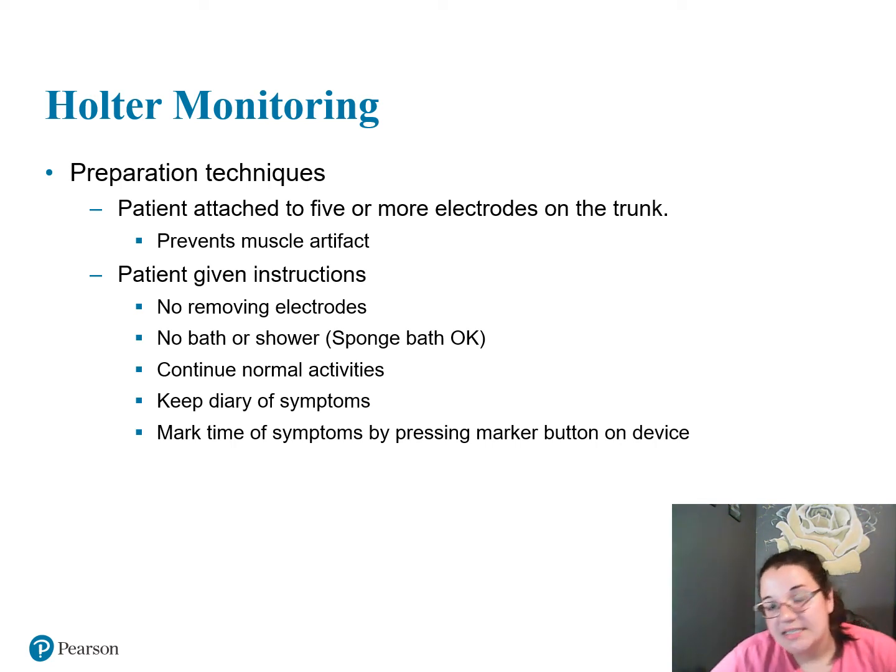So the patient is attached to 5 or more electrodes on the trunk. When we talk about the trunk, we're talking about the torso, right? The trunk of the body, to prevent muscle artifact. The patient is given instructions, and you have to know these by memorization. Are the patients allowed to remove their electrodes? No. Can they take a bath or a shower? No. You want to get them electrocuted? No. They can have a sponge bath.